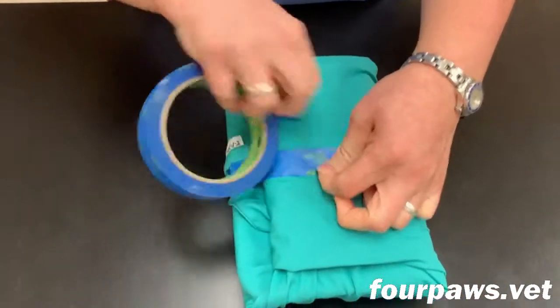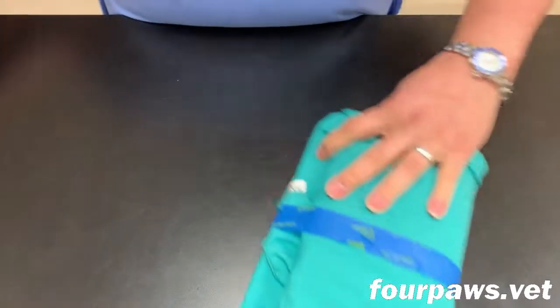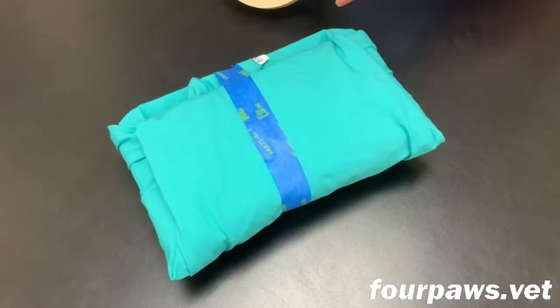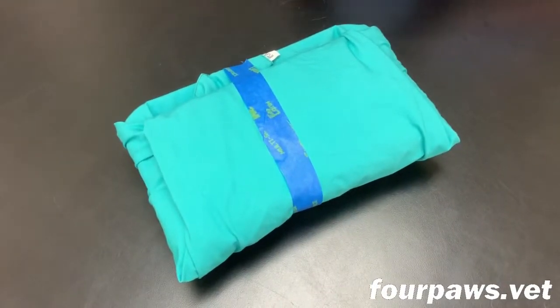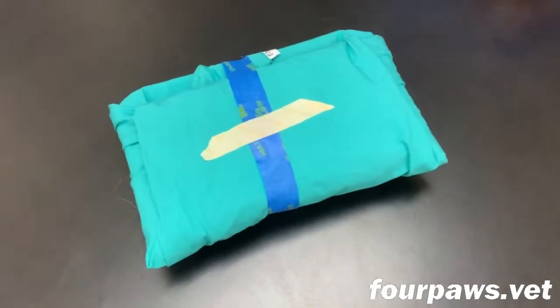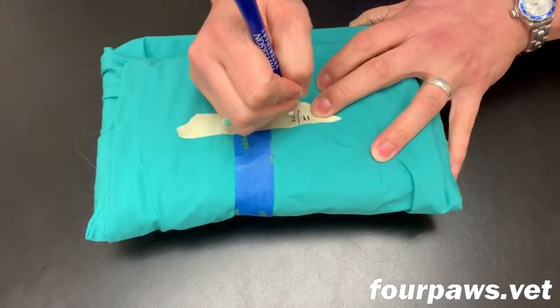Finally, some tape is applied to keep the pack wrapped snugly throughout the sterilization procedure. The blue tape is just plain old painters tape, but the most important part is applying a strip of indicator tape. Just like the indicator strips inside the pack, the indicator tape will let us know when this pack has been sterilized properly.